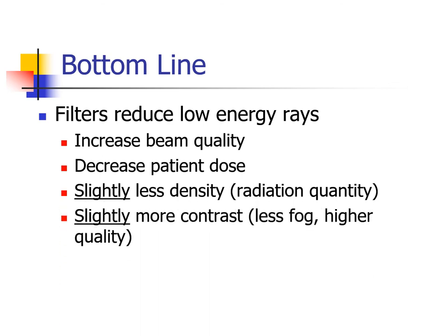Low energy X-ray photons are also more likely to be absorbed in the patient's tissues and are more likely to scatter. Since a filter reduces low-energy photons, one can surmise less scatter production will reduce fog reaching the image receptor. Less fog means an increase in contrast of the final image. For digital systems, higher contrast on the receptor means a higher contrast resolution in the displayed image.